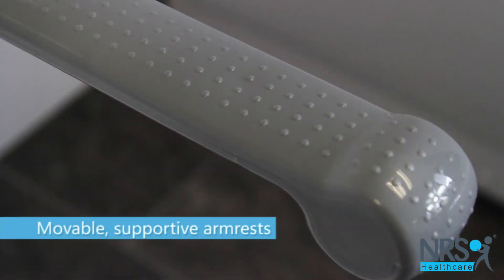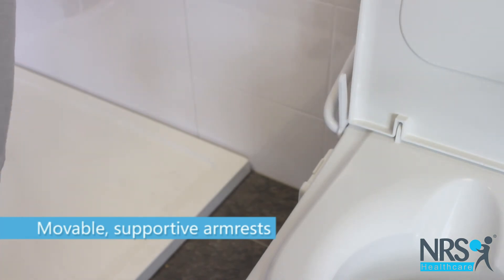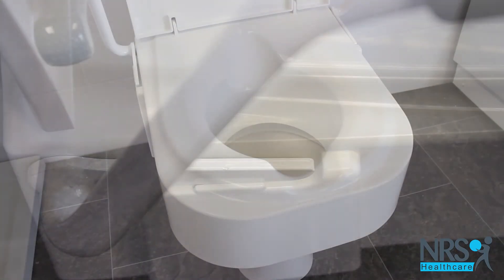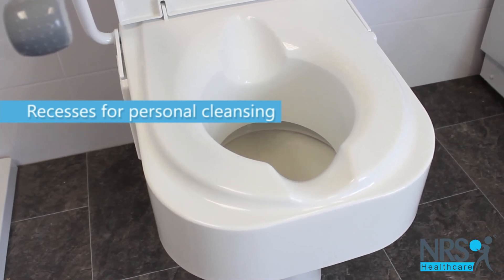It features supportive armrests that can be moved up or down to help transfer onto the seat. The seat features front and back recesses to help with personal cleansing.